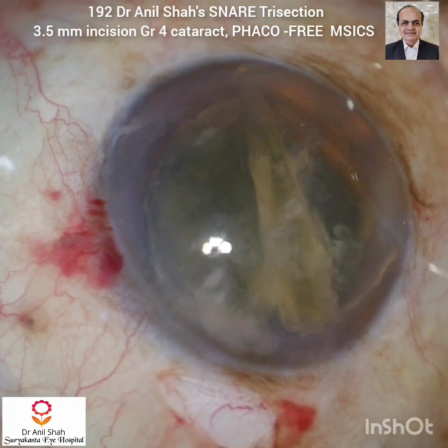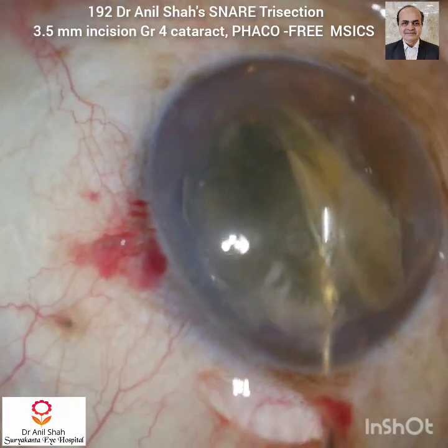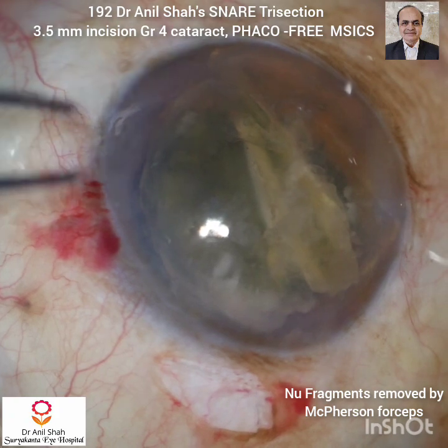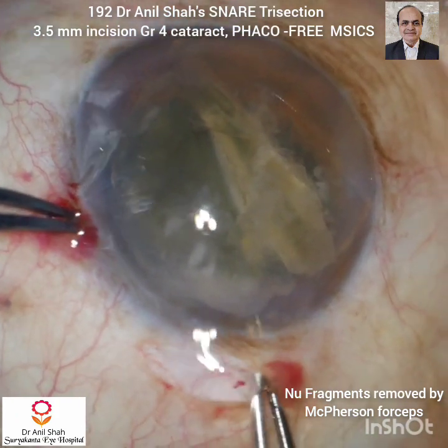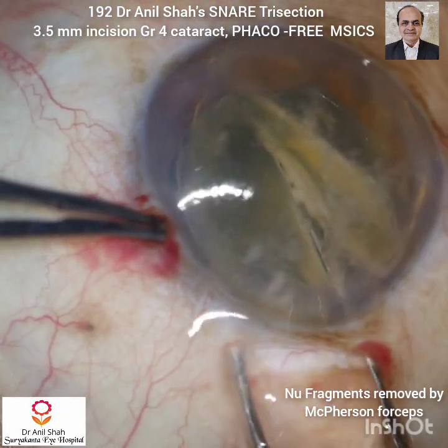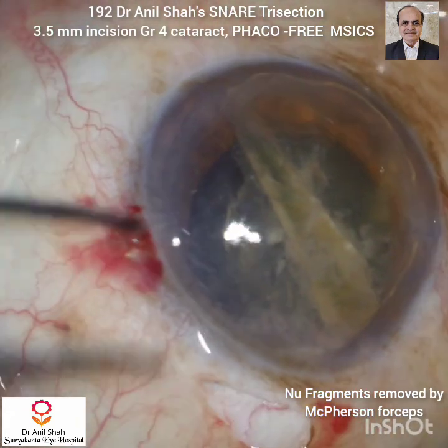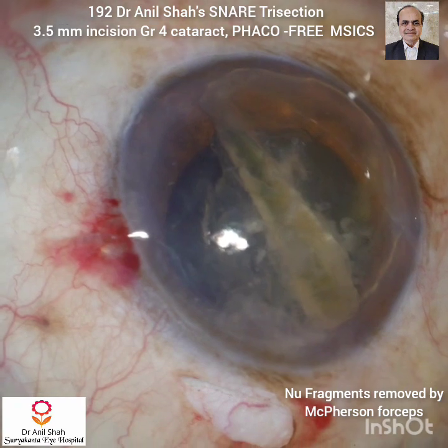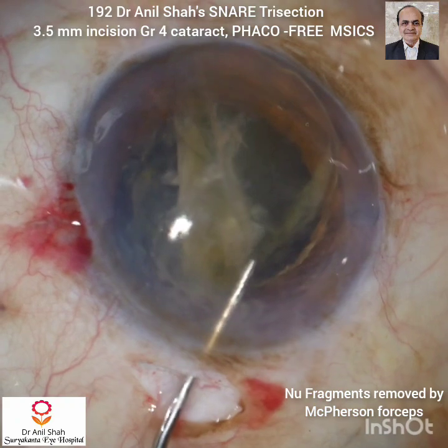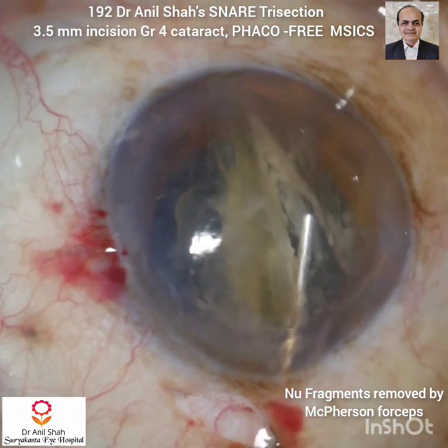Now with HPMC I will separate each nucleus fragment. I prefer McPherson forceps for removing nucleus fragments. The main important trick is to pass the McPherson forceps along the entire length of the nucleus. Hold the nucleus but do not press it. The one pole of the nucleus should be above the inner corneal incision. If it is below the inner corneal incision then the fragment will go into the angle and will not come out of the tunnel.